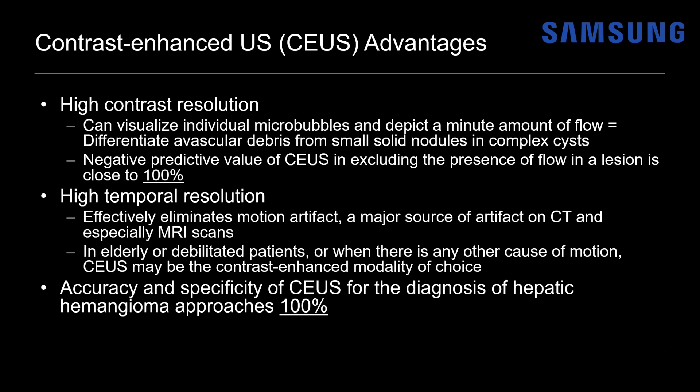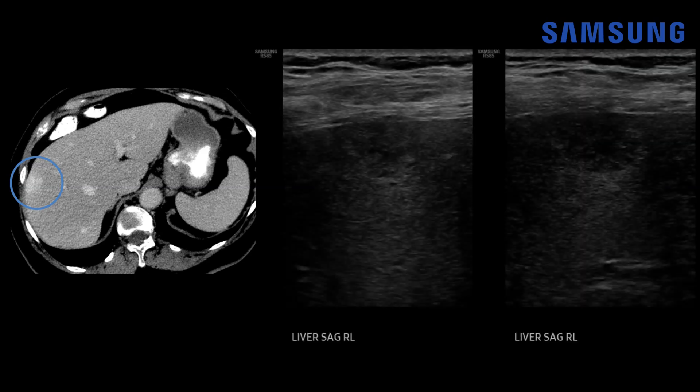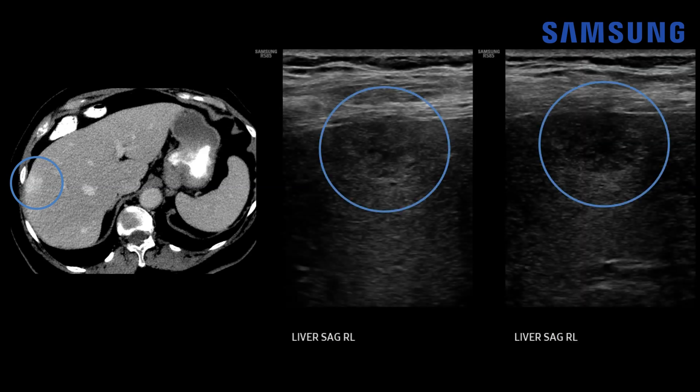Let's look at some images. This was an older female patient presenting with a new primary diagnosis of malignancy. On her staging CT abdomen and pelvis, a hypervascular lesion in the subcapsular right hepatic lobe was identified. There was obvious concern — could this be a metastatic lesion? On ultrasound, we could see this heterogeneous hypoechoic lesion with a faint surrounding halo of echogenicity.